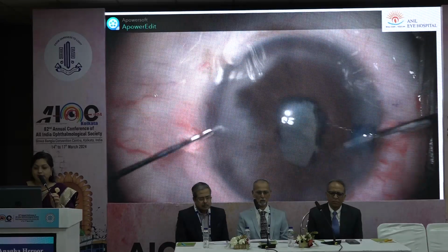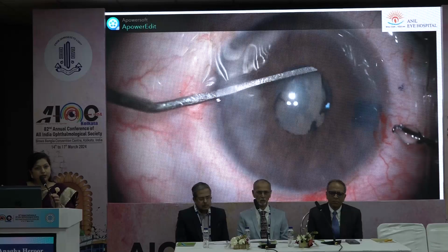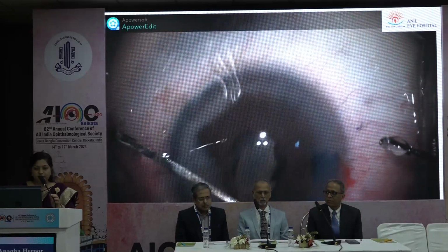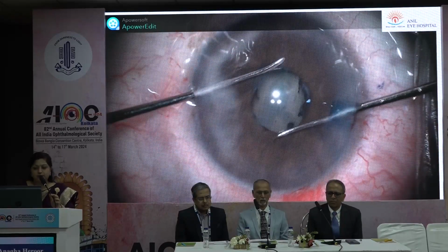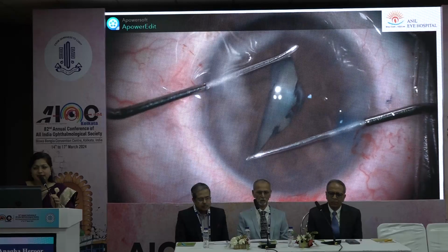So this is from one side and then on the other side. But as you can see, even after doing the synechiolysis, the pupil has not really opened up so well. So we need a slightly larger pupil for better surgery. So I'm just doing a gentle stretching.